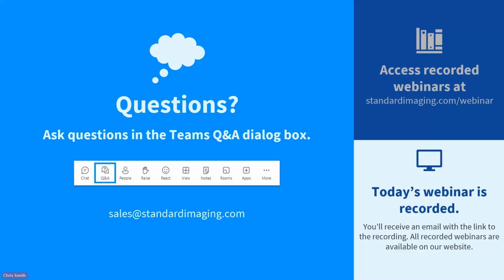So that's kind of the value prop of what we're doing. We're talking a lot about the administration and a lot about how we're trying to bring people together and how we're trying to standardize across your clinics. And we're going to have actually a look here at the software in just a moment.